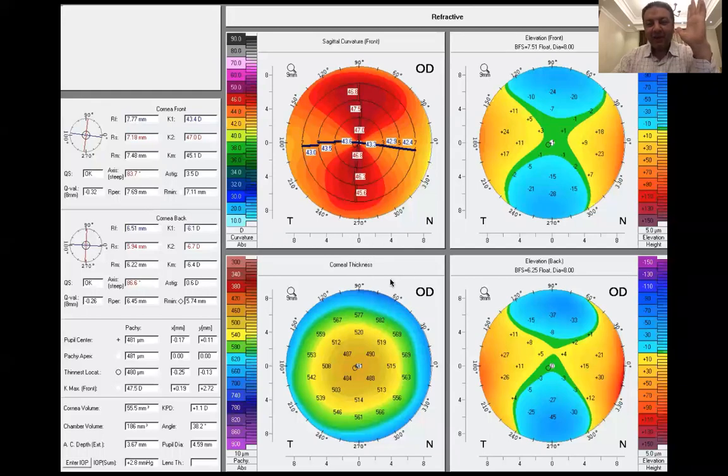Okay, can I ask a question? Yes, please. Let me ask the question in another way. How many degrees of myopia will you correct with PRK? Whether the ablation depth is acceptable for you to do with PRK: 70 microns, 80, 90, less, more? The highest degree that I treat by PRK is -8 spherical equivalent.